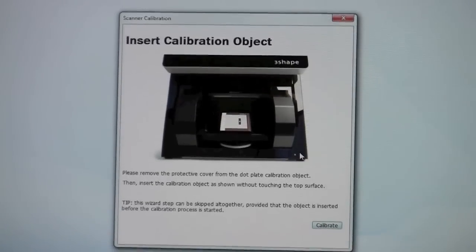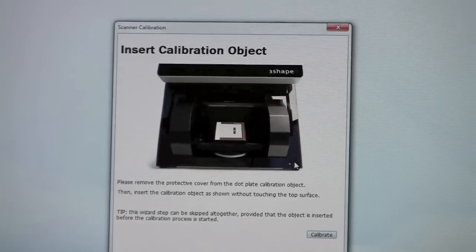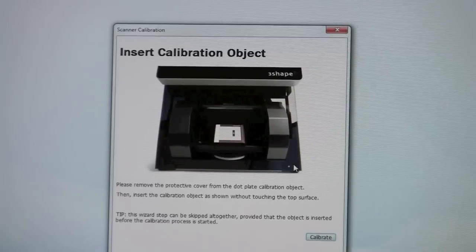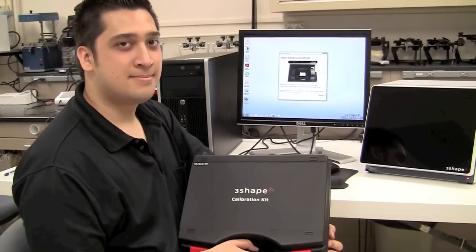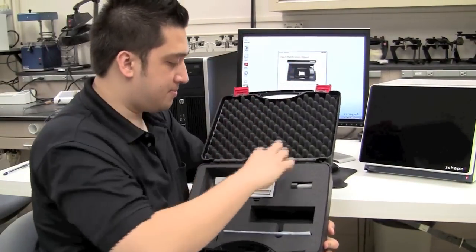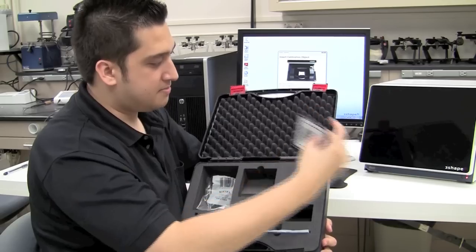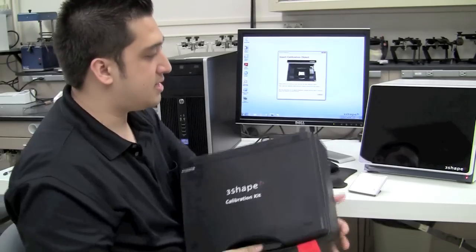We're going to simply follow the instructions laid out for us on the screen, as well as the on-screen text. We'll start by getting our calibration object out of the calibration kit that was included with the scanner. Inside the calibration kit, we get out our calibration item — it should just be this one object — and I'll go ahead and set this down on the table, close the kit up, and set the box aside.